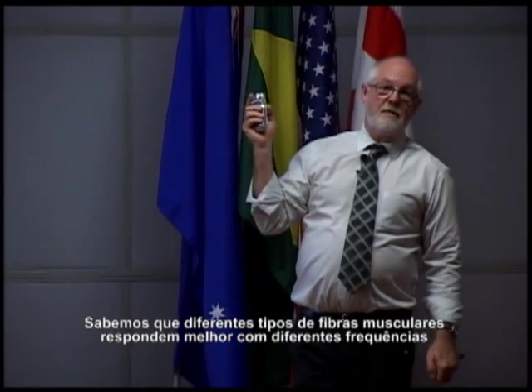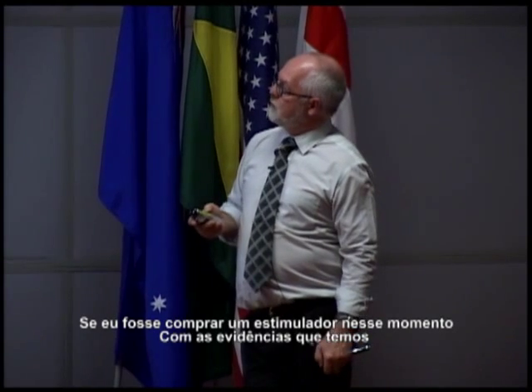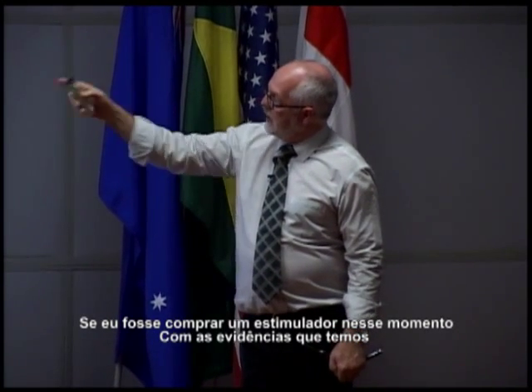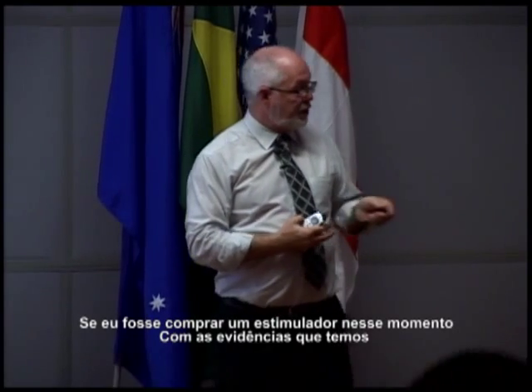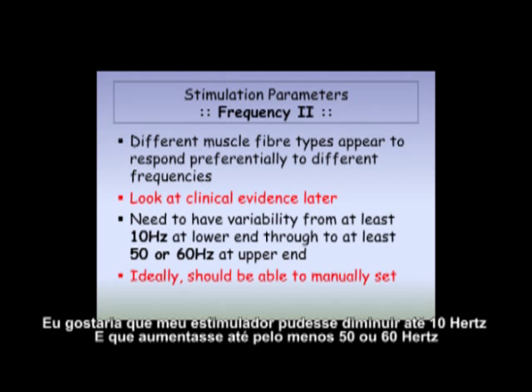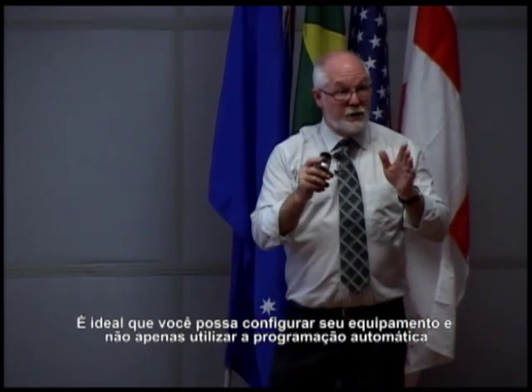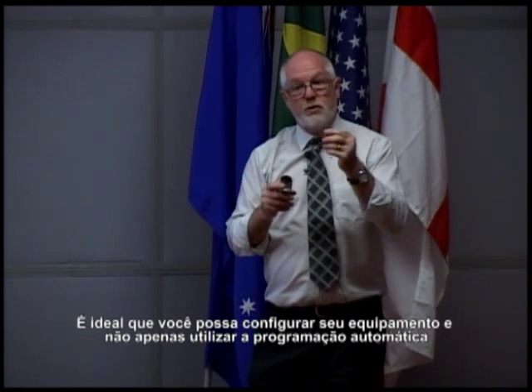We know different muscle fiber types respond best to different frequencies, or we think we know different fiber types respond to different frequencies. If I was going to buy a stimulator, at the moment, with the evidence we have, I want my stimulator to be able to go down as low as 10 hertz. And I want it to go up as high as at least 50, maybe 60 hertz. That's my range to be clinically effective. And ideally, you should be able to set that machine, not just use automatic programs.